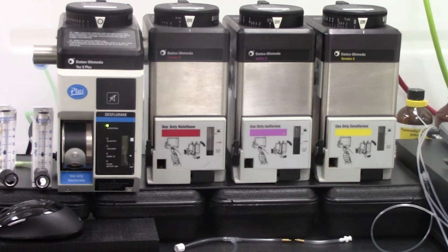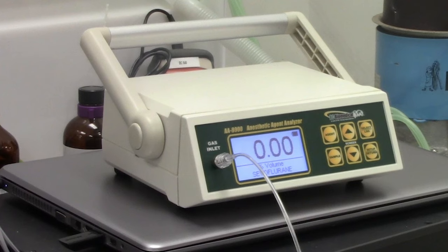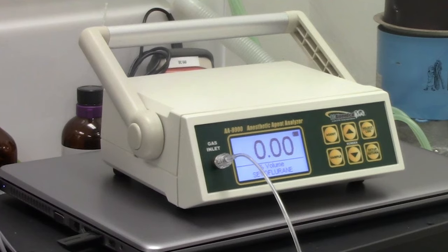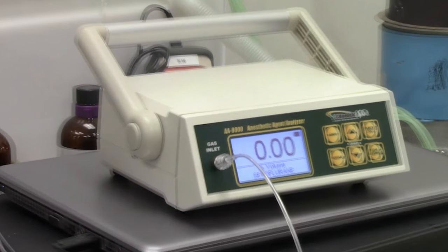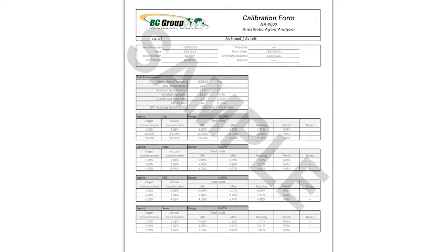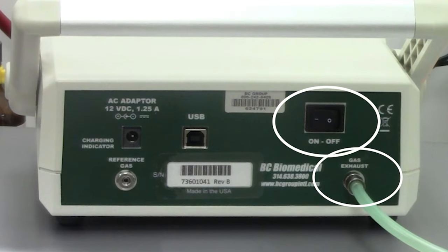To test your anesthetic agents you will need scavenger tubing and the AA-8000 Anesthetic Agent Analyzer. The AA-8000 includes a 12-point calibration certificate. Notice on the back of the Analyzer is the gas outlet and the power switch. The Analyzer can be battery operated or line powered.